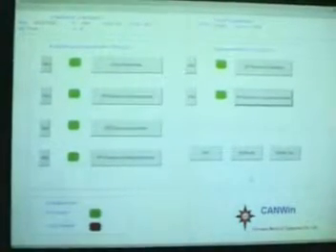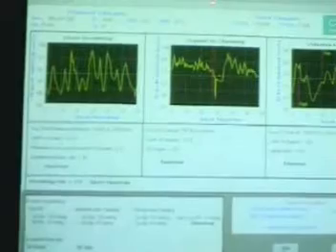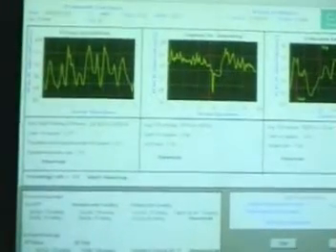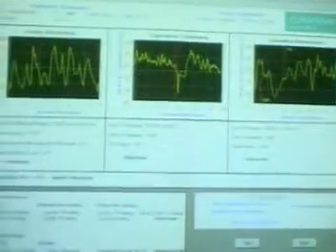Now the 4 tests in parasympathetic and the 2 tests in sympathetic are over, which is indicated by the green light. Now we shall go to the result. This finally gives us the entire result of the patient, and the entire test appears to be within normal limits.